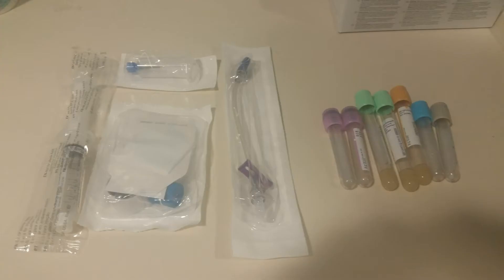In addition, you need a bunch of equipment to make sure you're functional. You need a start kit — these are commercially prepared and contain tegaderm, tourniquet, tape, and gauze. In addition, you'll need a flush, you'll need a connector, you'll need a vacutainer, and you'll need whatever blood tubing your nurse needs from you.